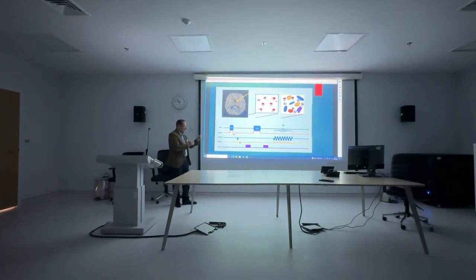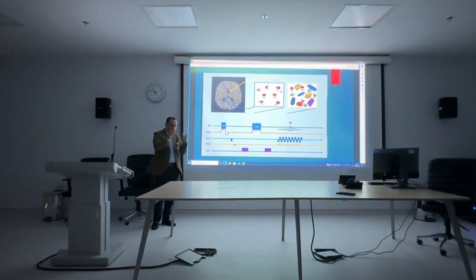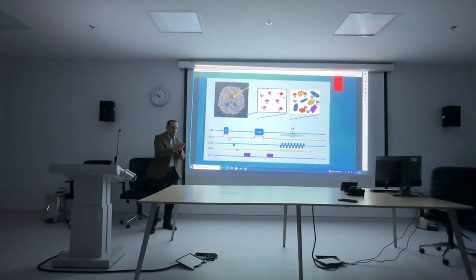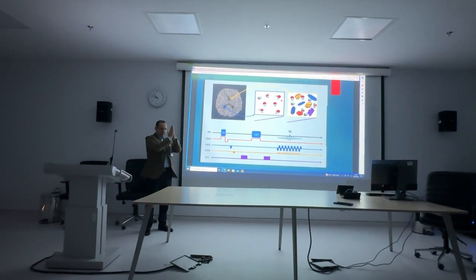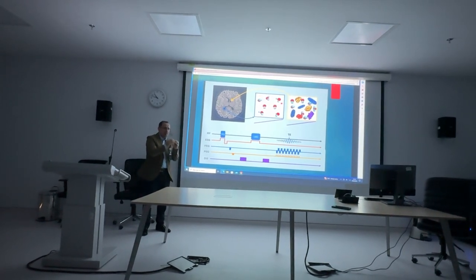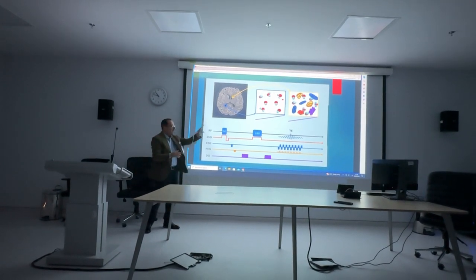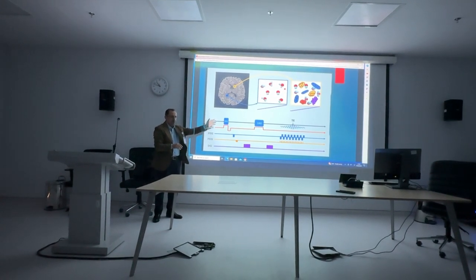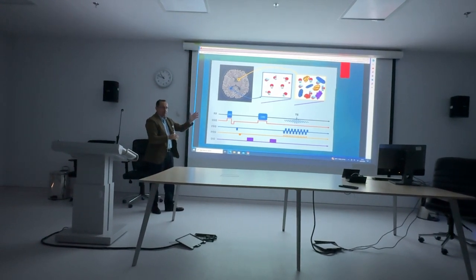So by application of this, we are achieving marked dephasing due to the continuous movement of the particles which are free. We can't regulate them, this is fast and this is slow, and collect them in one area to give a signal. So the result is loss of signal due to this gradient in regard to the free movement particles. Let's go to the compact particles or the limited type of tissue, which I think we can call by now restricted diffusion.